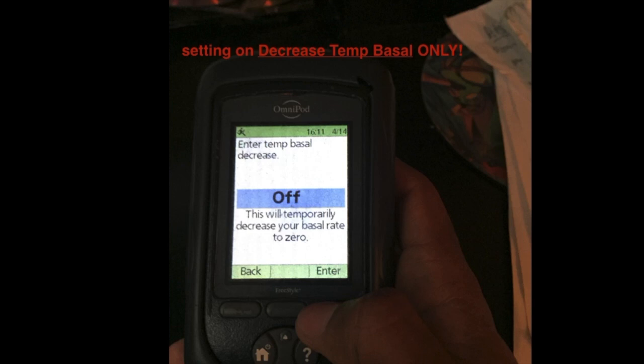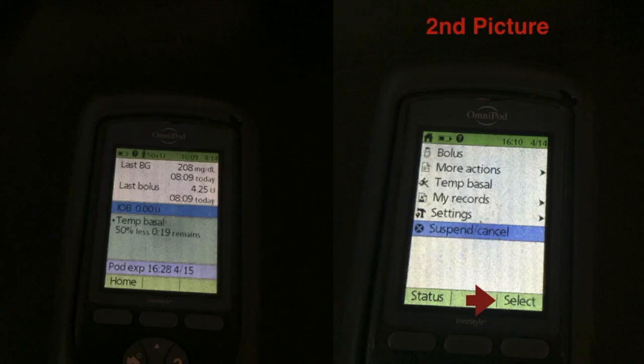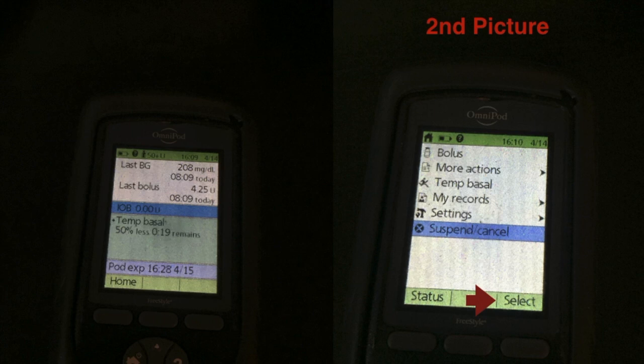Now I'll show you how to turn it off. You start with the left picture — I already had the Temp Basal turned on with 19 minutes left at 50% less; I think I was exercising. You hit the home button, which takes you to the second picture with the screen items. You'll see the suspend/cancel button, hit select, then cancel the Temp Basal rate and confirm — that will turn it off.